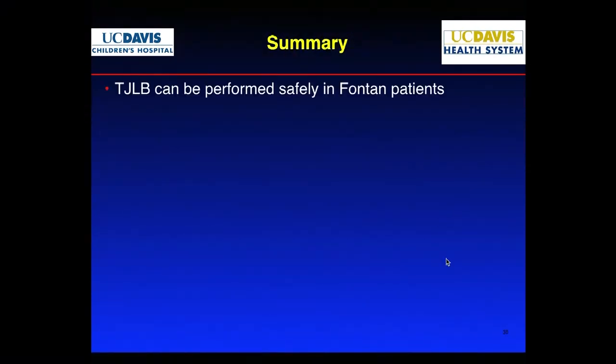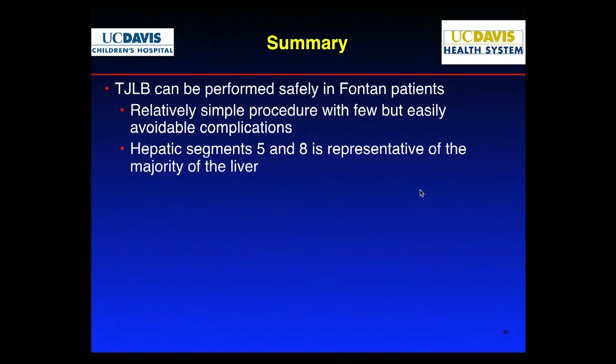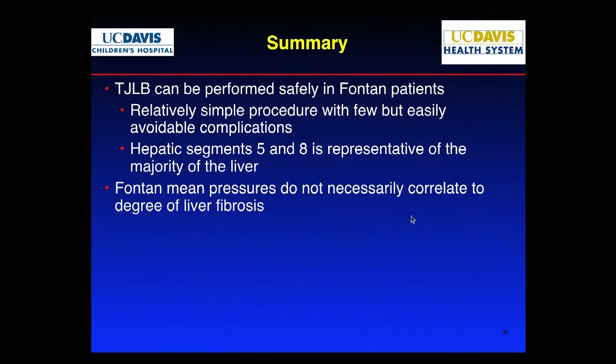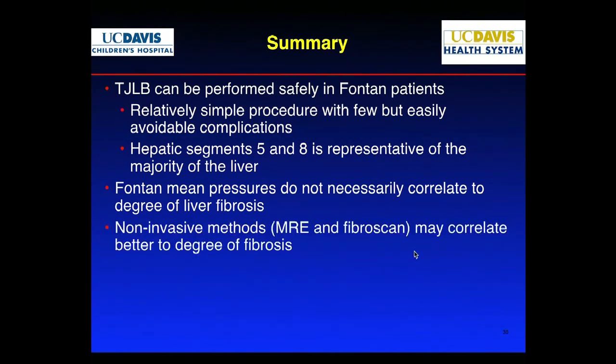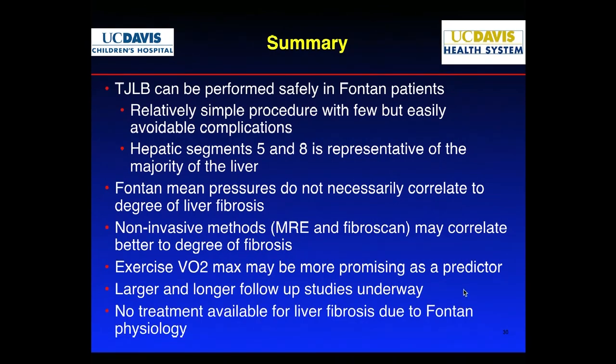But let me just summarize that the transjugular liver biopsy can be performed safely in Fontan patients. It's a relatively simple procedure with a few easily avoidable complications, and I went through that. We typically use the hepatic segments 5 and 8 to get to that majority part of the liver. Fontan mean pressures do not necessarily correlate with the degree of fibrosis. There are definitely lesser invasive ways to correlate this. And again, this is all part of the study right now. We think that the exercise physiology may be a promising predictor. And of course, there are longer and larger follow-up studies that are on the way. And right now, we don't have any good treatment for dealing with this fibrosis in the liver due to the Fontan physiology. But again, the studies are ongoing.